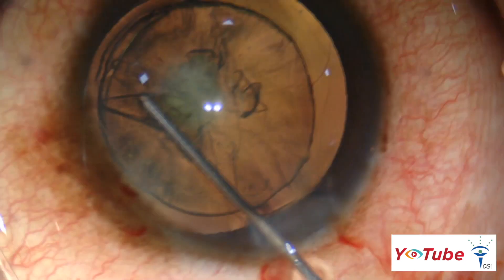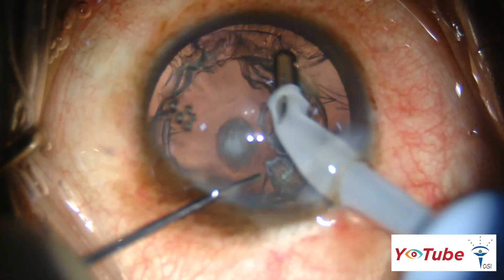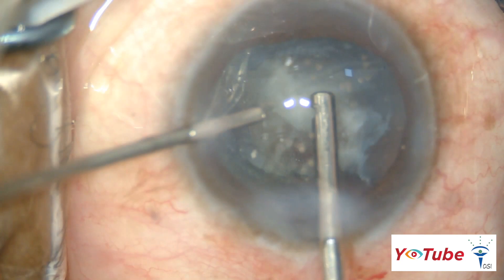By following these 10 tips meticulously, excellent outcomes can be obtained in patients with posterior polar cataract.